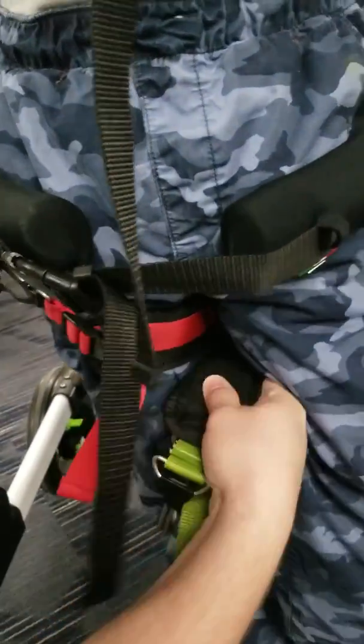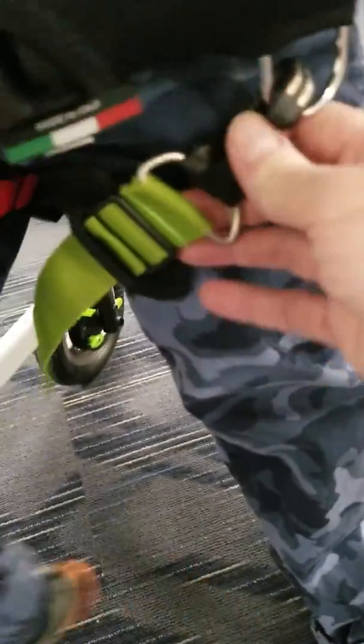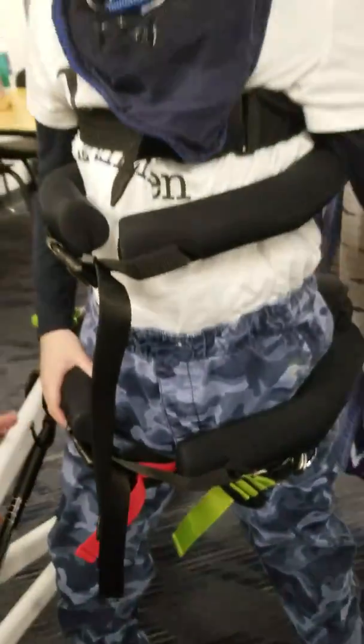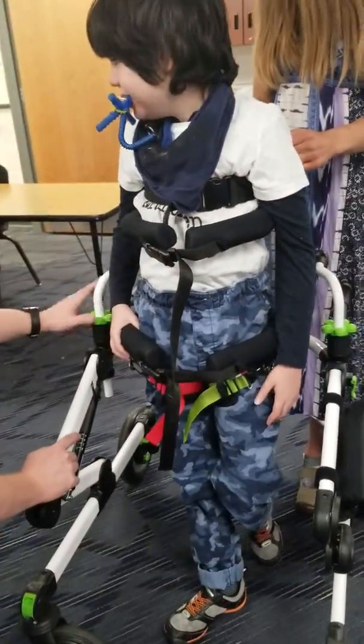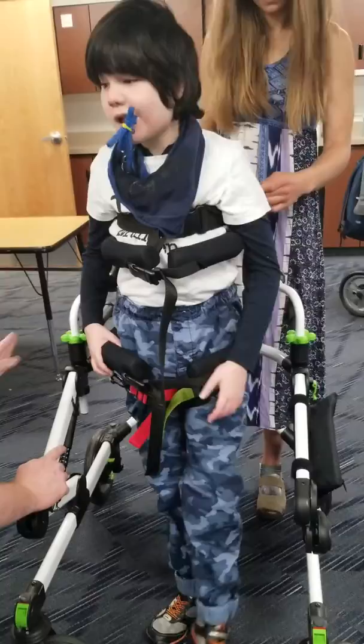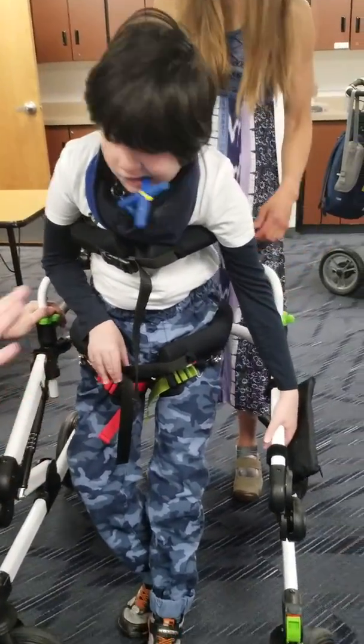And so then we get the other one and we do the same, because it's easier sometimes to clip it. And so we flipped it around to have it. There you go. And then here's this hand rest. If we're going up to the table, we just turn these to the back so that we can get a little closer. But if we were walking or something, we would flip them over because it gives him a nice little spot to hold on to sometimes when he's doing it.